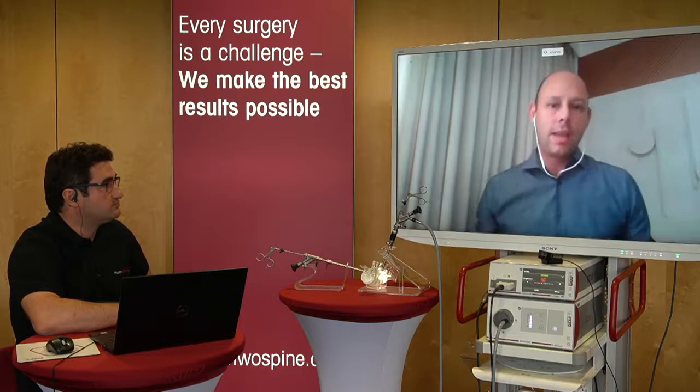Yes, I normally use the interlaminar approach to remove a migrated disc herniation. But I wanted to remove this disc herniation from the transforaminal approach to take this case and to develop the transforaminal technique for migrated disc herniation. But it's totally possible to use the interlaminar approach. It's a good access. I use the interlaminar approach in 80% of my cases.